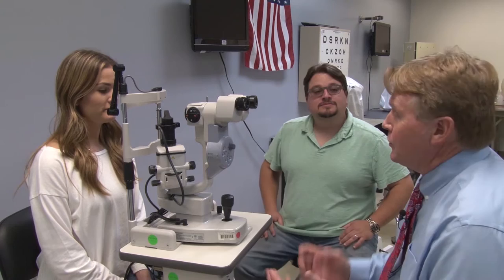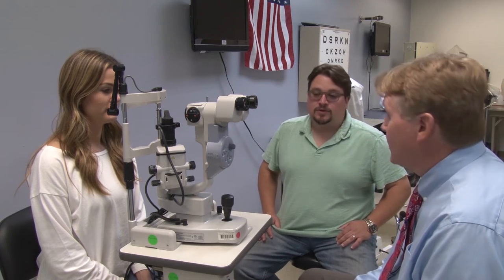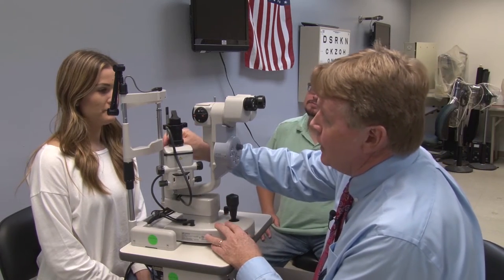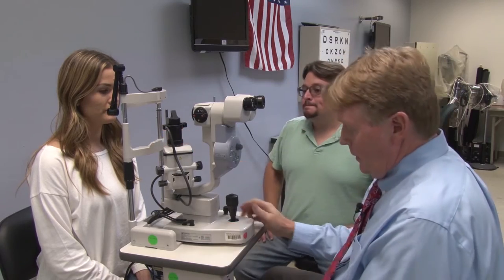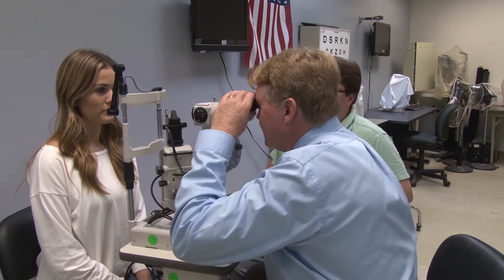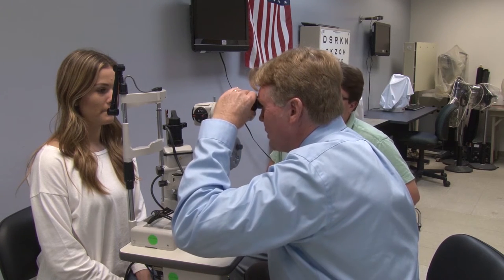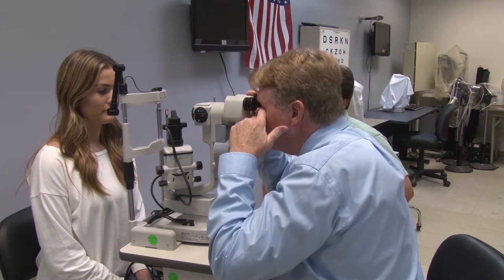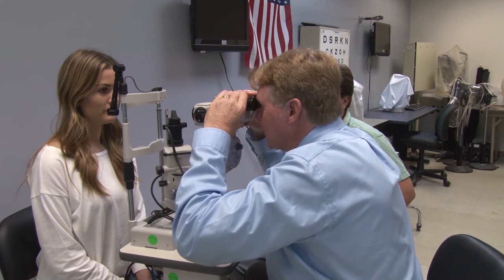Today we're going to go through the step-by-step procedure to do a pre-fit slit lamp exam. As you recall, the first step is always to focus the eyepieces. We take and put the focusing rod in there and turn the instrument on. Take a look at one eye at a time — turn it counter-clockwise until it blurs and then back clockwise to have a nice sharp focus. Same thing for the other eye. Then with both eyes open, move it back and forth like a pair of binoculars until you have comfortable binocular vision.